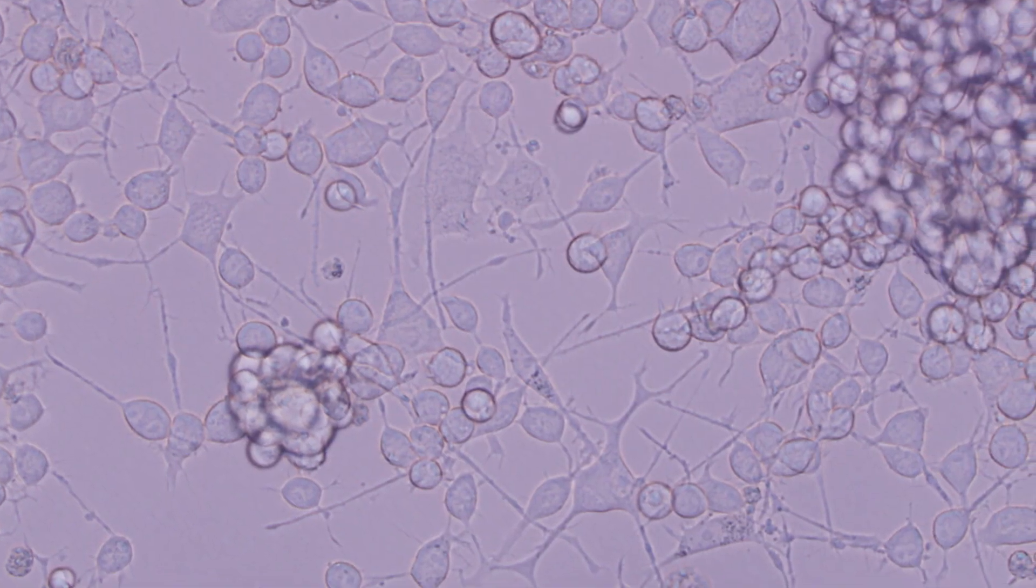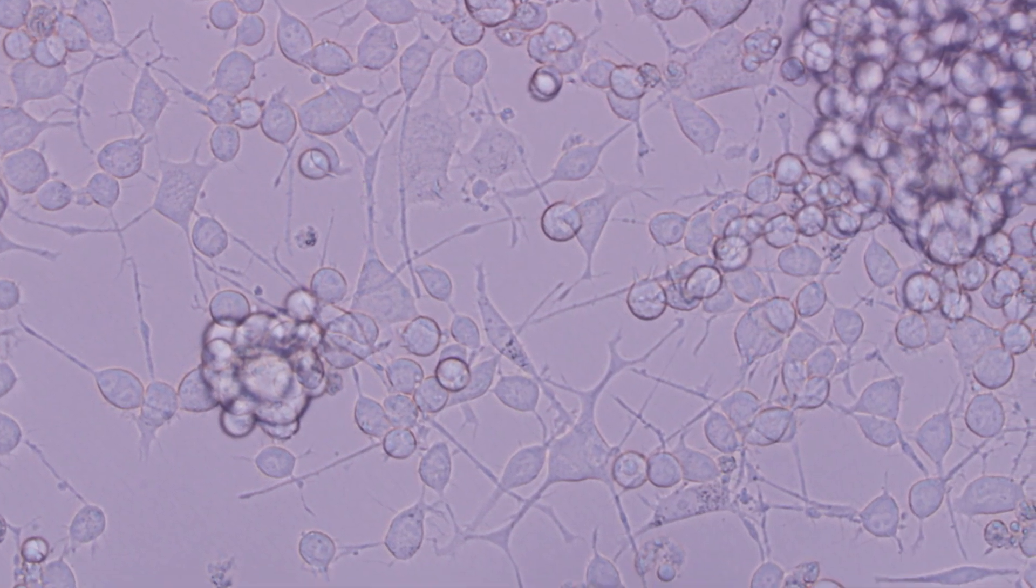The cells we will use in this lab is called PC12. PC12 is an established cell line initially derived from a rat neural endocrine tumor. It is an excellent tool to study cell signaling events triggered by growth factor like EGF which we will use in this lab.